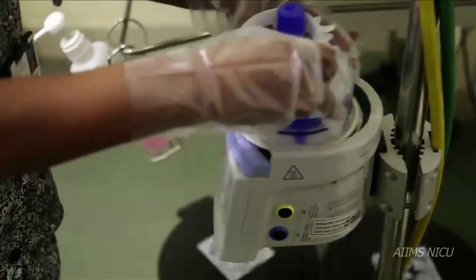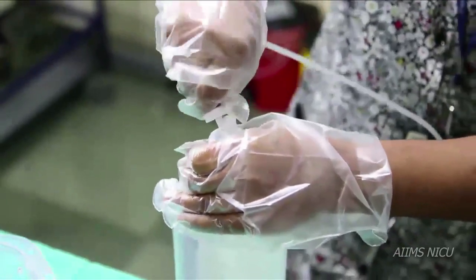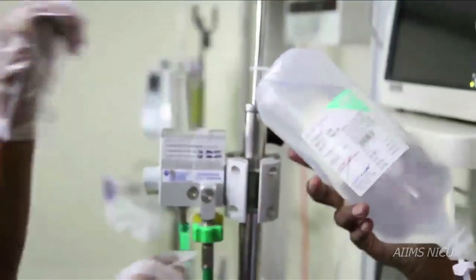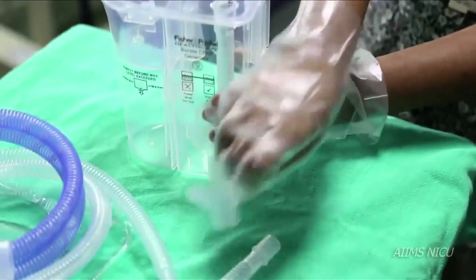Fix the water chamber onto the servo humidifier and fill it with distilled water. Use the autofill option of fixing the distilled water bottle to a stand for filling the water chamber.